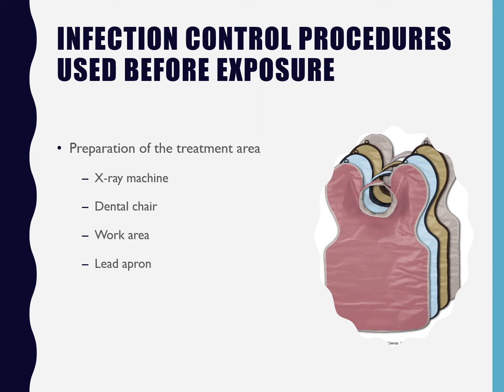I just want you all to know that everything we talk about here stays the same for every single patient, no matter what. It is inappropriate for us to treat any one of our patients differently based on something that they have disclosed to us. Okay, so before procedures, we want to prepare our x-ray machine, right?